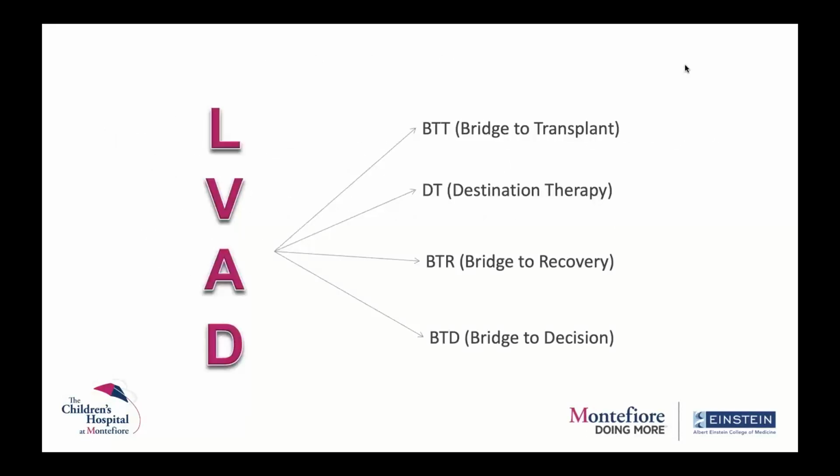So VADs can be used in multiple ways. So an LVAD can be used as a bridge to transplant, destination therapy, bridge to recovery, and bridge to decision. And we'll go over some of these.